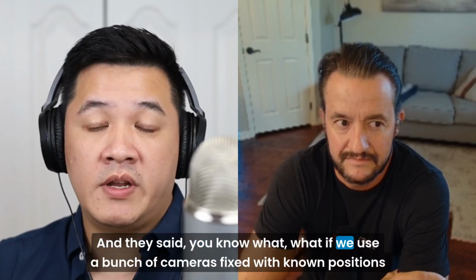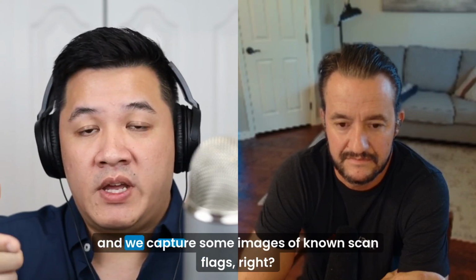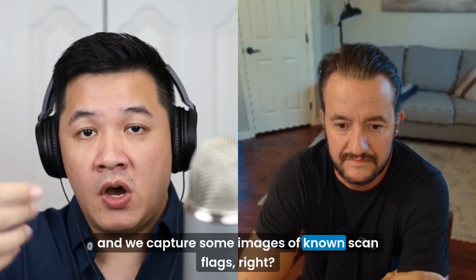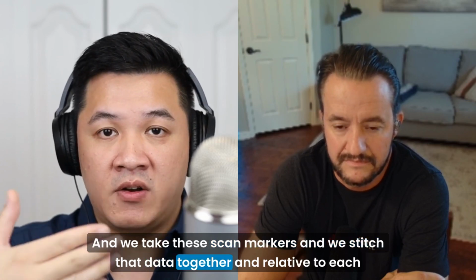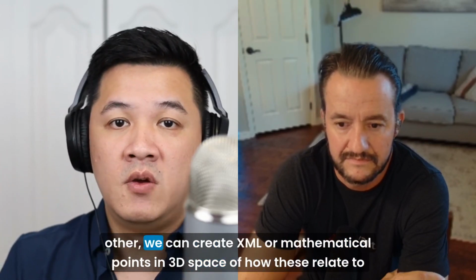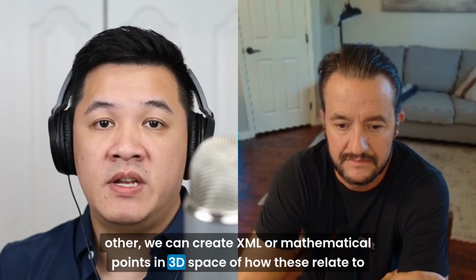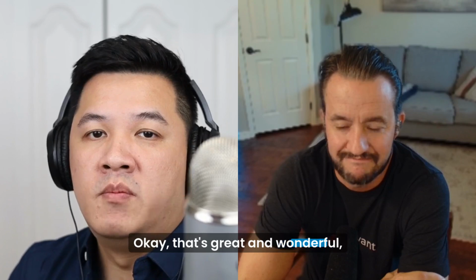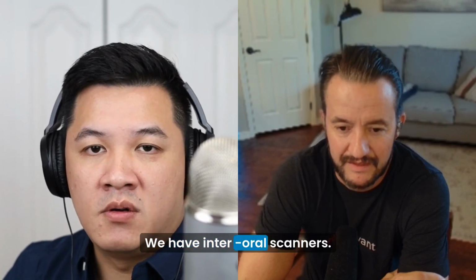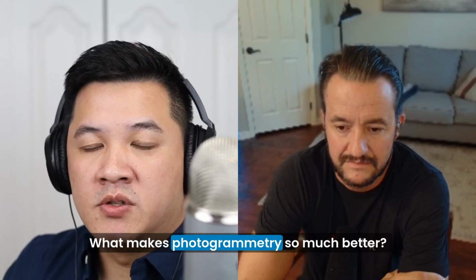They said, what if we use a bunch of cameras fixed with known positions, and we capture some images of known scan flags? We take these scan markers and stitch that data together, and relative to each other, we can create XML or mathematical points in 3D space of how these relate to each other. Okay, that's great and wonderful, but why does that matter? We have intraoral scanners, we have many different ways of capturing data. What makes photogrammetry so much better?